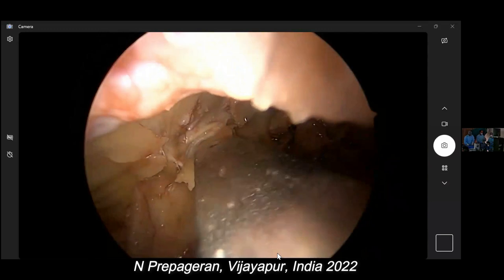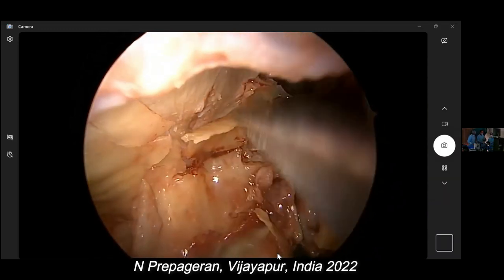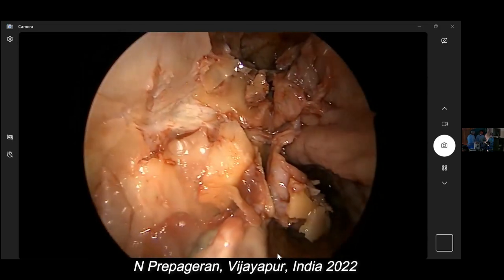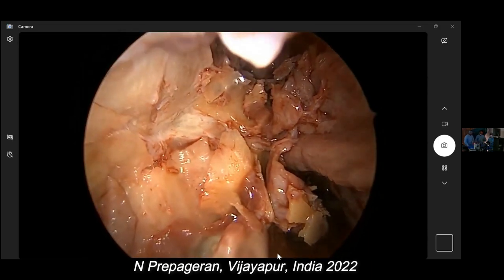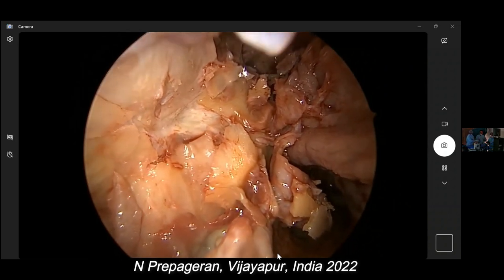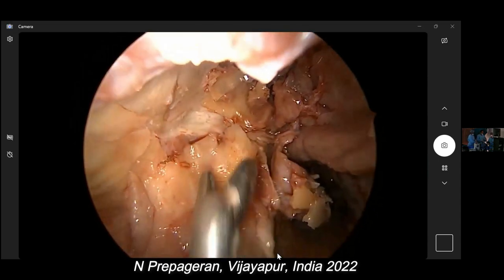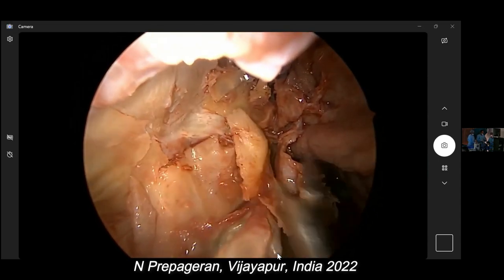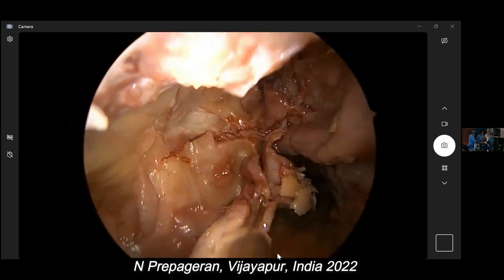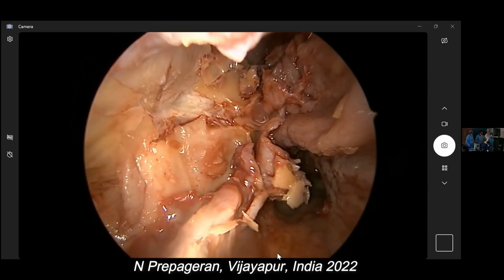So now I'm going to remove the bone here. Can you see? Do the dissection exactly like how you will do your surgeries. Step by step, layer by layer. Don't jump the sequence, then you will lose the track. It's like running a marathon. Run the first kilometer, second kilometer, third kilometer. Don't run straight away to the 11th kilometer.